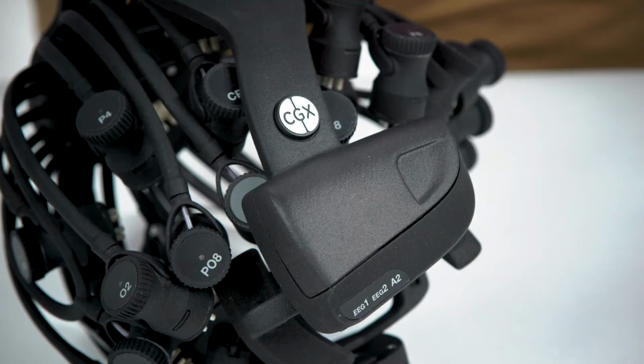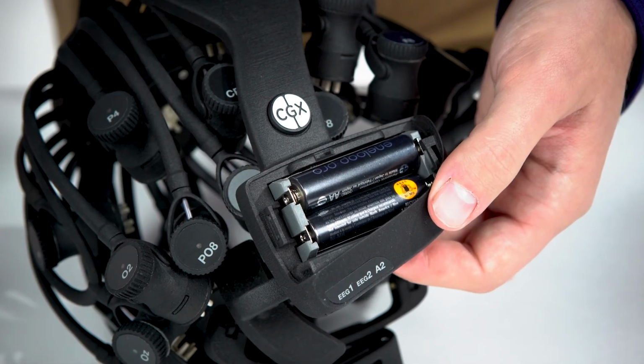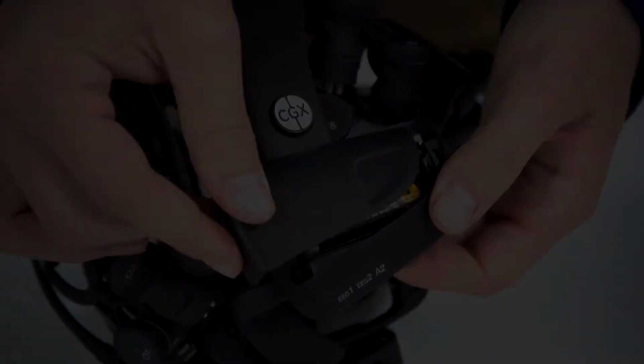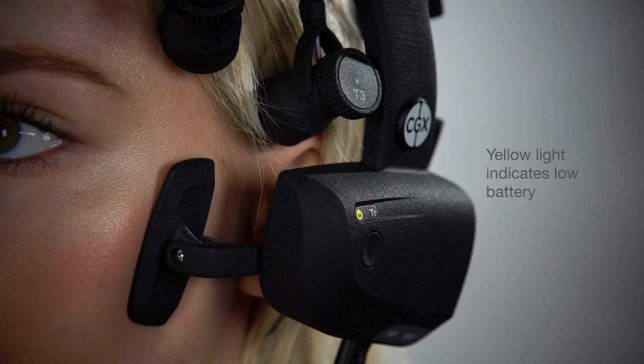Use fresh, fully charged alkaline or nickel metal hydride batteries. To install, slide open the battery door on the A2 handle. Remove the batteries if the headset will not be used for a few days or longer. Push the power button on the A1 handle to turn on the headset. It will turn green. The power light turns yellow when batteries are low and red when critically low.